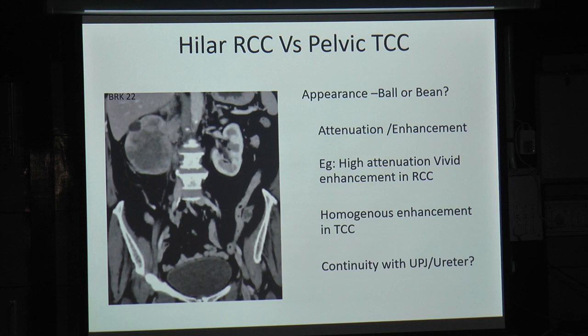They can be if they are left for a very long time. So, whenever you have a CT scan picture, look at shape, ball or bean, attenuation, homogeneity, and the center of the tumor, where is it localized? I will discuss why the center of this tumor matters after my next slide. I will tell you a very important thing. But here, the tumor in the ureter and pelvis: anything that goes into the pelvis and ureter is TCC unless proved otherwise.